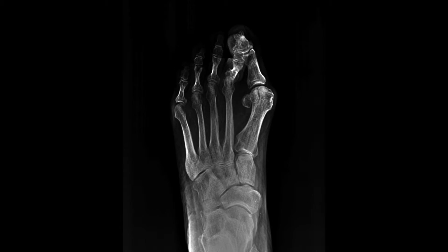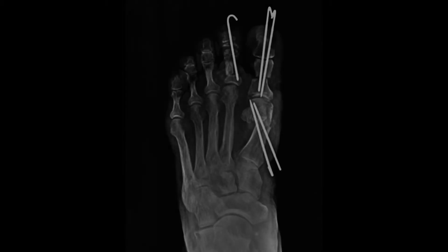When we show this patient one week after surgery, we're doing studies on this, and the fixation methods we're using are actually fairly good here. Let me show you how this looks after one week and how our fixation looks.